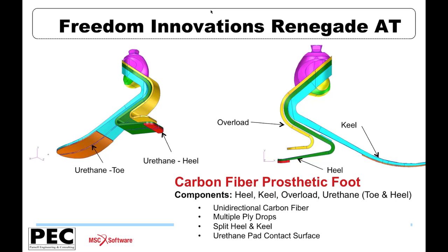Let's talk a little bit about some of the specific components of a particular carbon fiber prosthetic, names of the components, and a little bit of information on how they are constructed and designed. This primary portion of the foot that you see here is referred to as the keel. You'll notice that there is quite a bit of thickness taper in this component and in some of the others, but it's very apparent, I think, in the keel component.